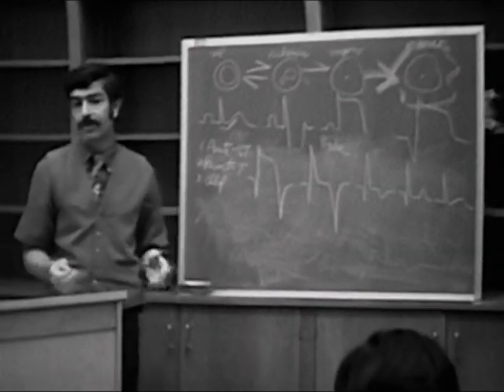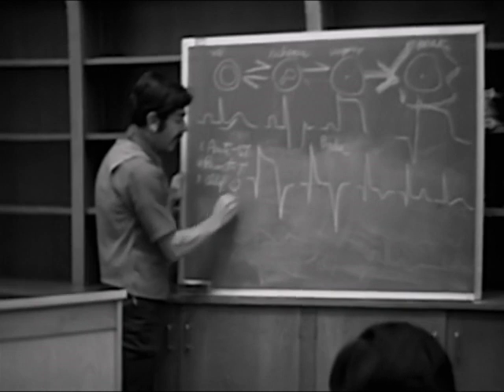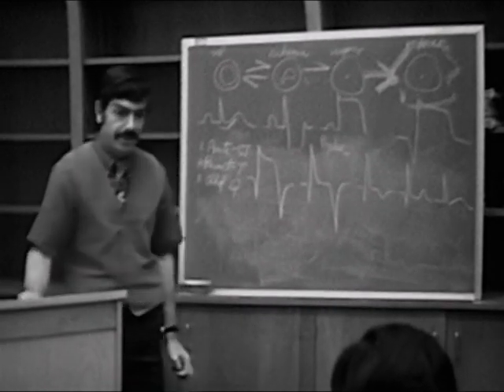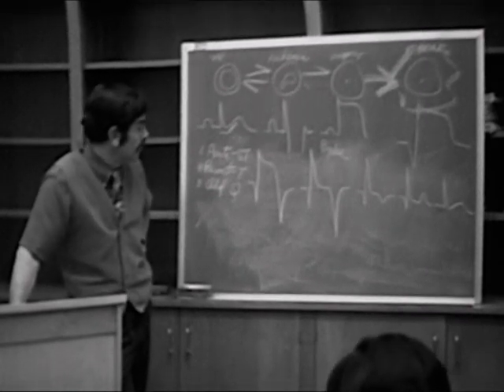And then in the old infarcts, what do you see? Q waves, right? You may see only a Q wave, and eventually those Q waves may disappear. They don't disappear in every case. As a matter of fact, I suspect they don't disappear in most cases.